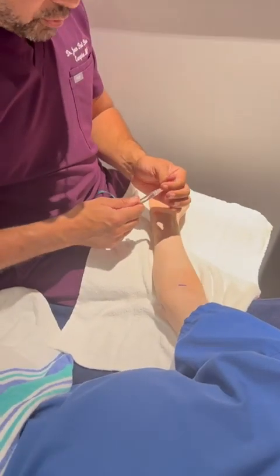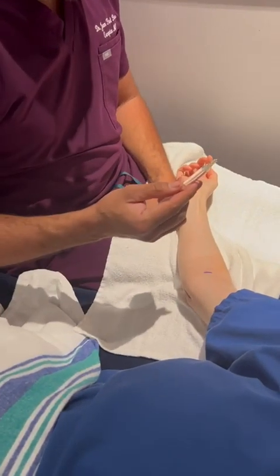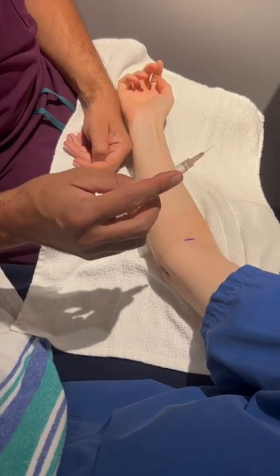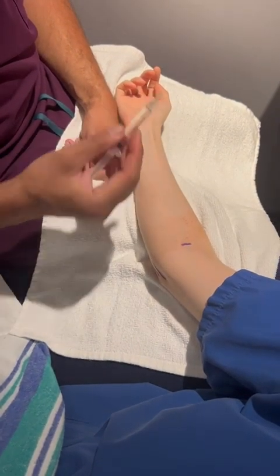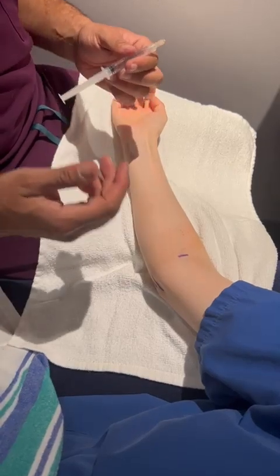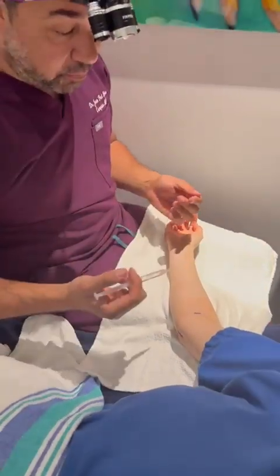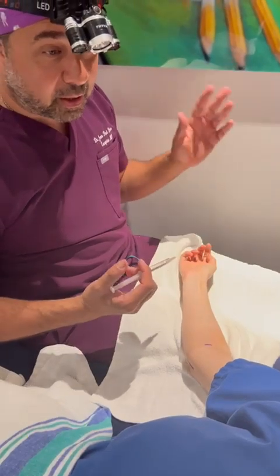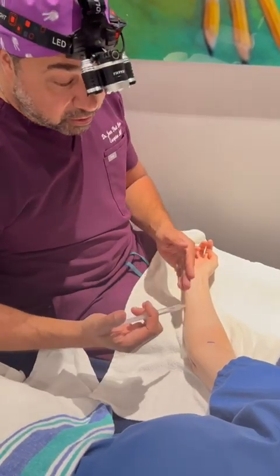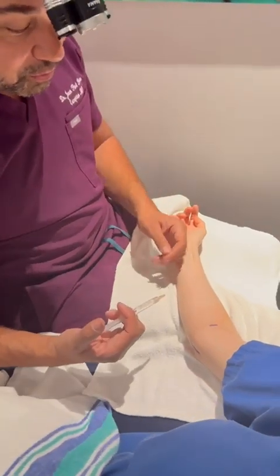The way we do this, first I would inject the skin only with a very fine needle — this is a 30-gauge needle — using what I call the mosquito technique. The mosquito has to sting you without being perceived, otherwise you're going to smash it and it's going to die. So if a mosquito can numb you without hurting you, then I should be able to do the same.